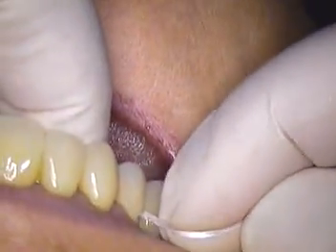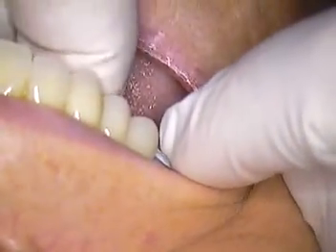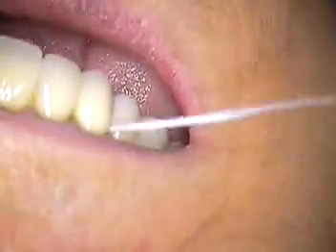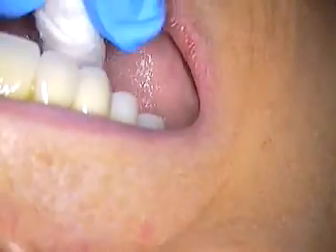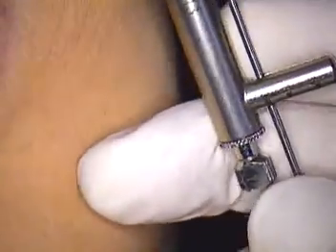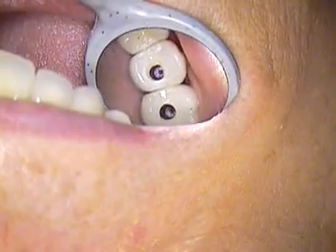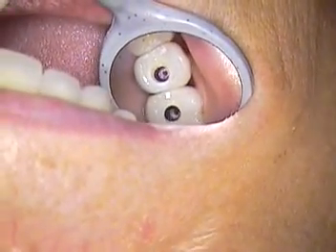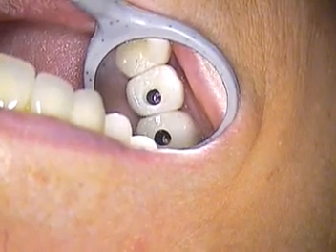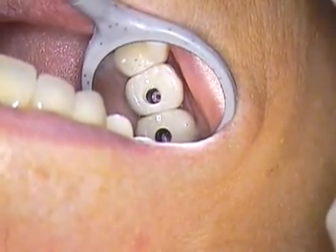We bottom it out, and then you want that little bit of snap to come through, like so. That's a nice snap. So if you've got that, I even checked the natural tooth. Then you go ahead and tighten one down, and after you've tightened the one implant down, you start tightening the other. But halfway through, say you go to 35 newton centimeters and it's getting tight and you're still worried — maybe I'm putting pressure on the threads, et cetera. Trust your brain. You need to go back in with the floss again.